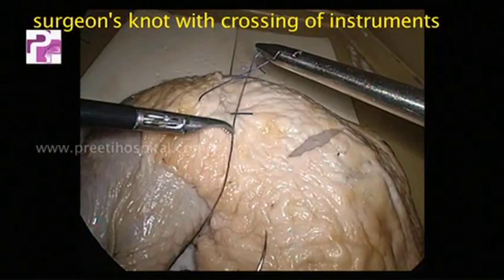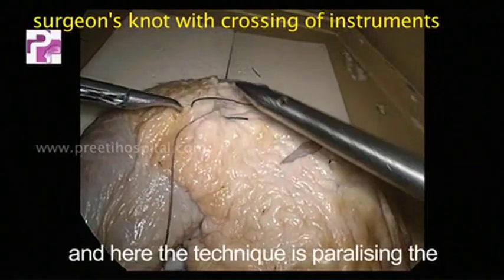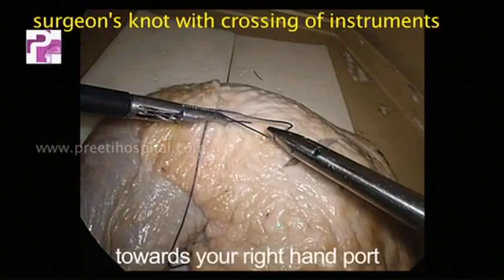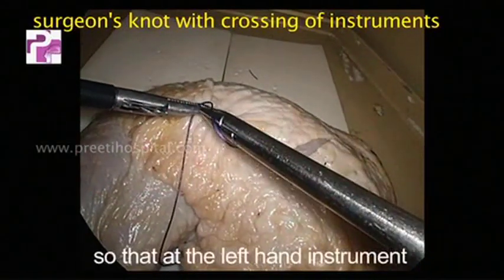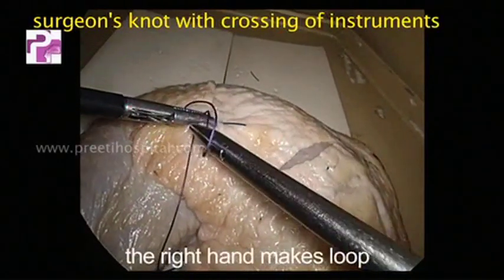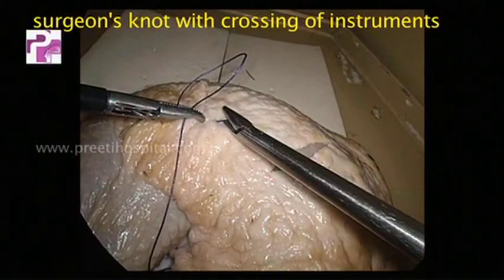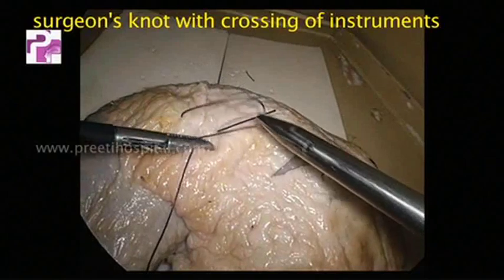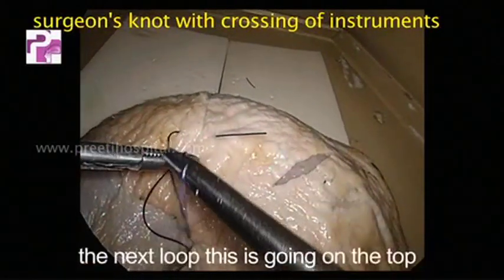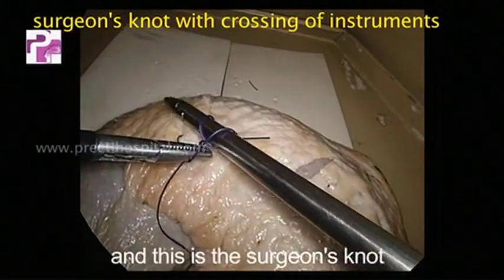You can readjust later on. The technique here is parallelizing the thread towards your right hand port, so that at the left hand instrument the right hand makes a loop, either from the top or from below. It should be opposite to the next loop. This is going on the top, and this is the surgeon's knot.